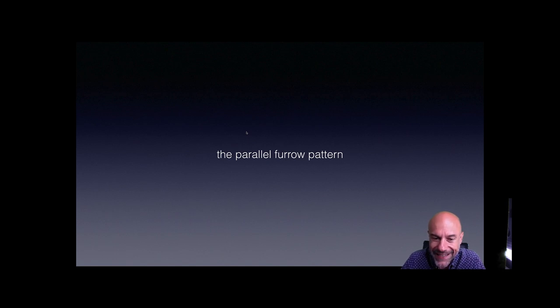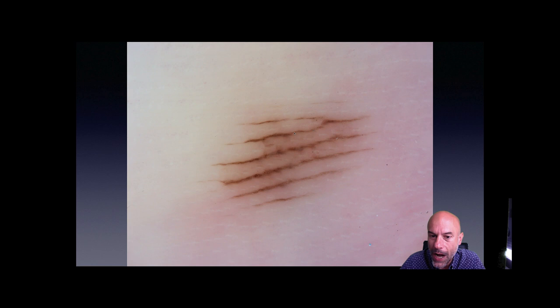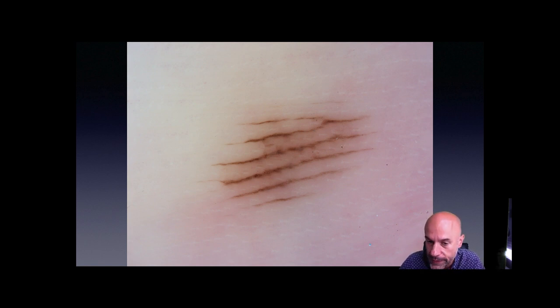Let's see a few more things concerning the parallel furrow pattern. Here is another typical example: parallel brown lines which are much thinner than the non-pigmented bands in between. We can also see the eccrine duct openings located on the ridge, which is not pigmented. So we are sure that the pigmentation is on the furrows — parallel furrow pattern.